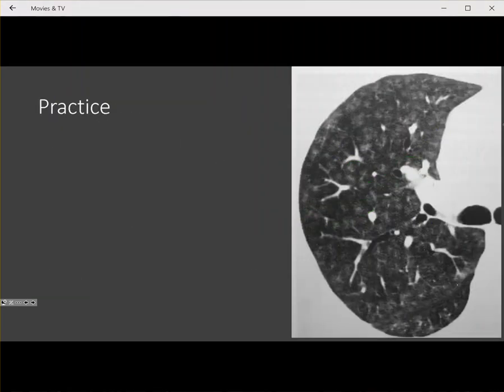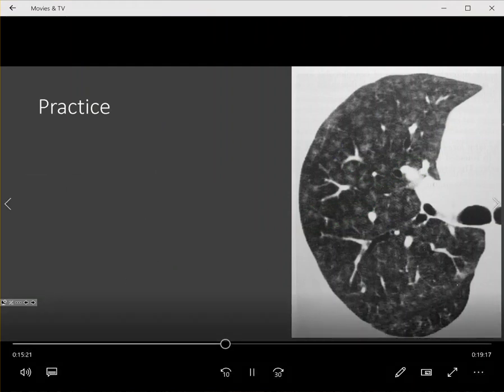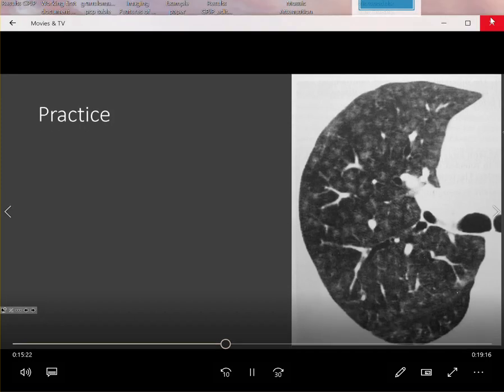So let's do some practice. Here's a case where we open it up on CT in axial images at the level of the carina. We look at this lung and we can see that there are several micronodules.